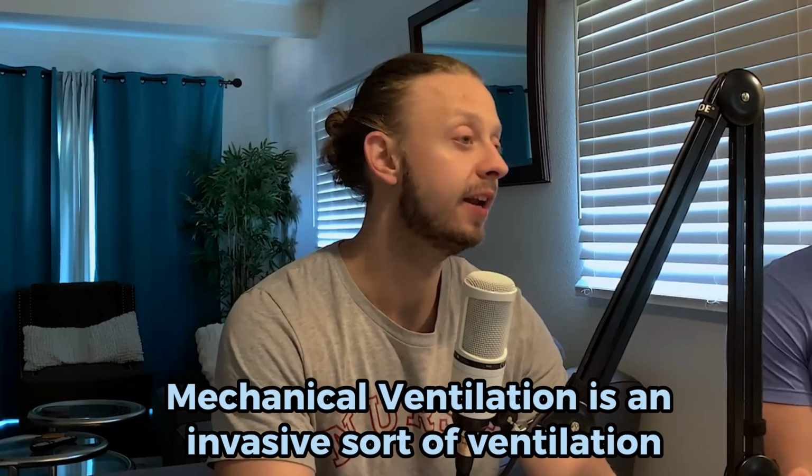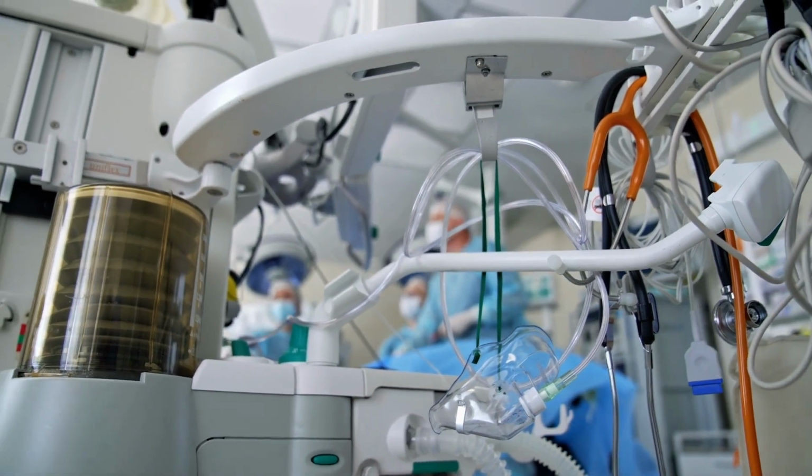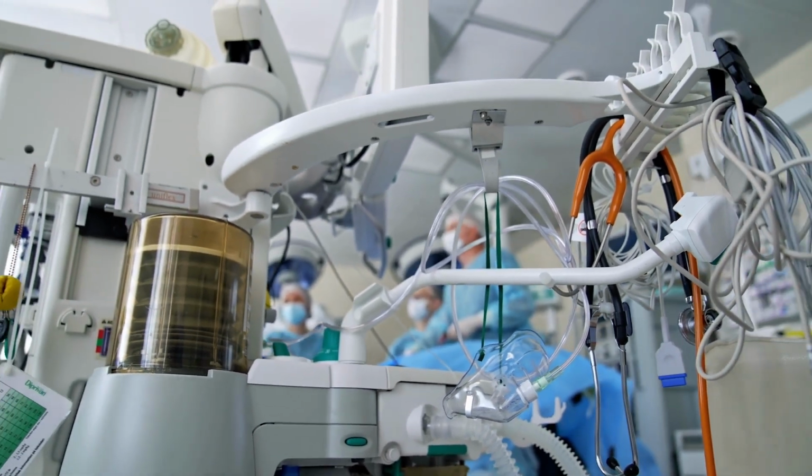Yeah, so mechanical ventilation, that's an invasive sort of ventilation. Of course, you have some other things that are non-invasive that also help with ventilation and oxygenation, like your CPAP, your BiPAPs, your face mask, non-rebreathers, all those things. But today we're going to talk more about the actual ventilator. So it's the more invasive, that's your full life support, you could say.